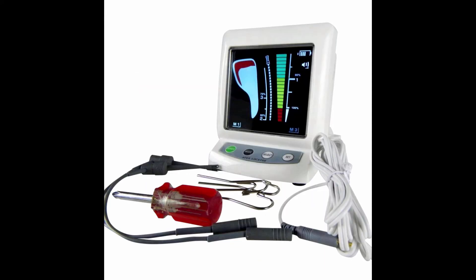Package includes: 1× Root Canal Meter Locator, 1× Probe Cord, 3× File Holders, 5× Contrary Electrodes. Warranty: 1 year. Weight: 0.45 kg.